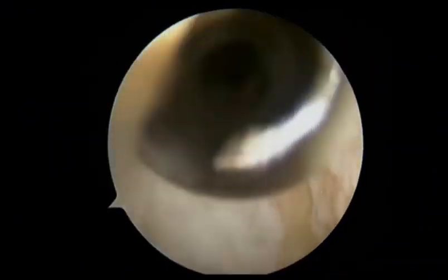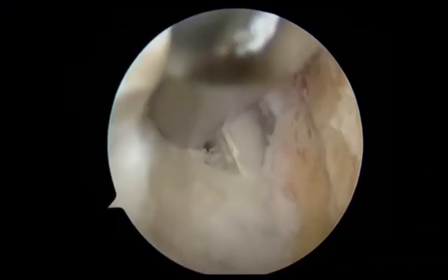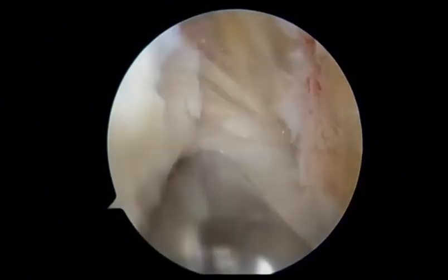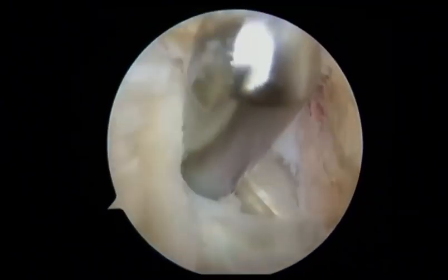The fourth step is to clean the calcified lesions on the posterior side of the patellar tendon and at the upper end of the proximal patellar tendon insertion. The shaver is first used to clean the calcification on the posterior side of the patellar tendon. Calcification often appears yellow, while healthy patellar tendon is white.